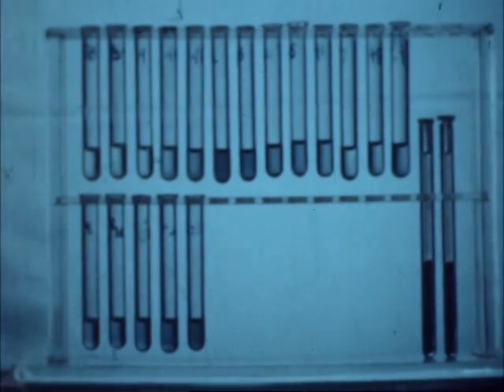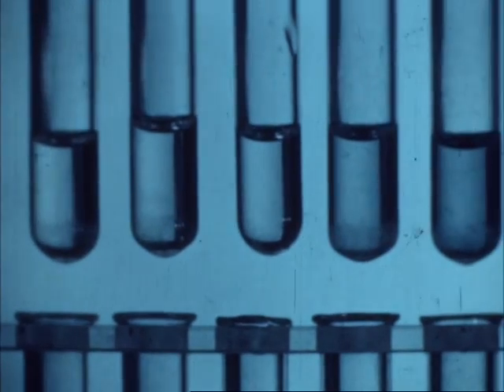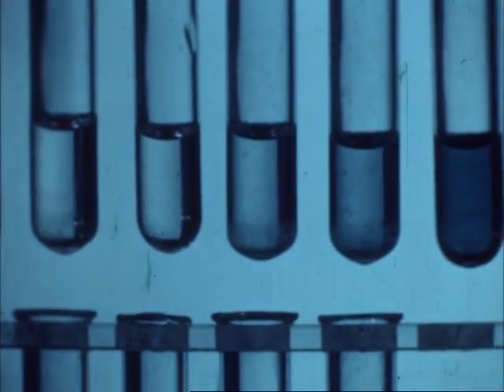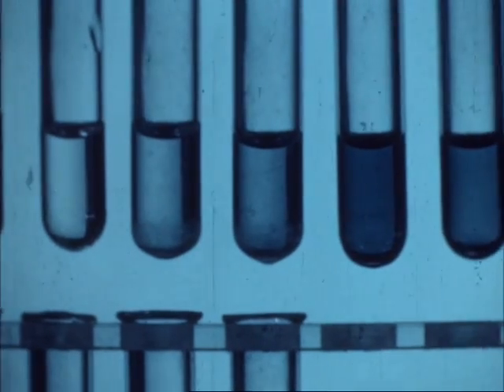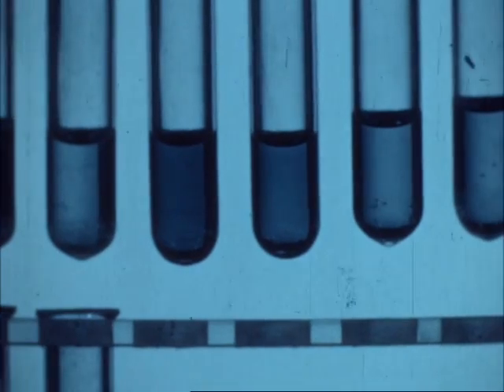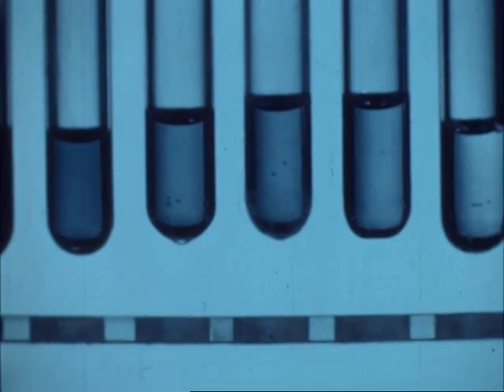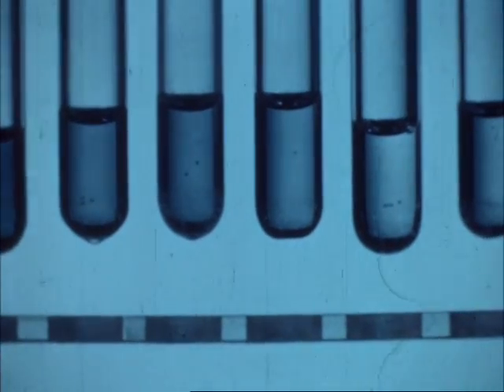The rising and falling concentrations of dye may be seen in the upper row of tubes. Two hematocrit tubes are seen on the right. Standard concentrations of dye made up in the same way are shown in the lower row. It will be noted in the upper row that dye appears in the fourth sample, reaches its maximum about the sixth tube, and then the concentration falls away more slowly, while after the 11th tube there is a secondary rise in dye concentration due to recirculation of blood containing the dye.